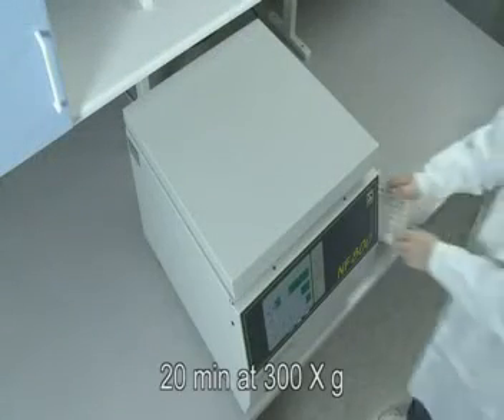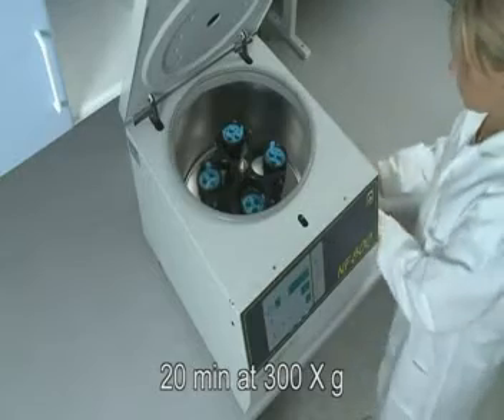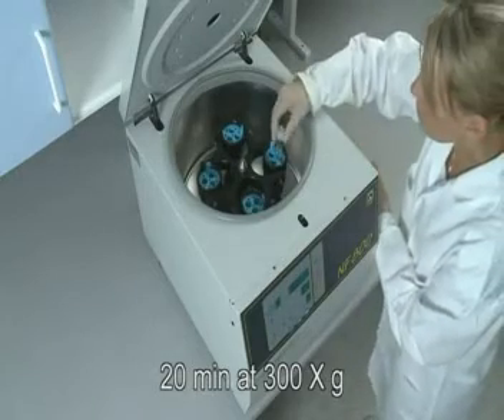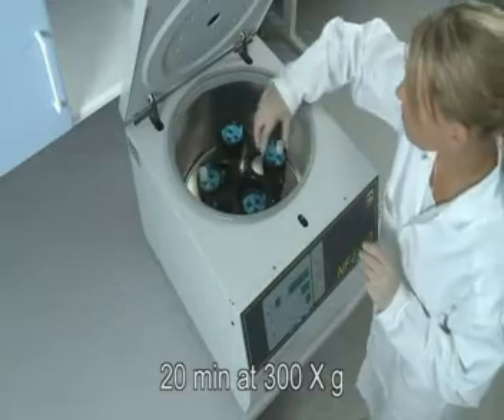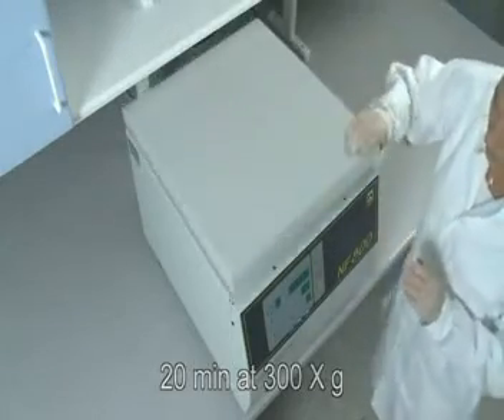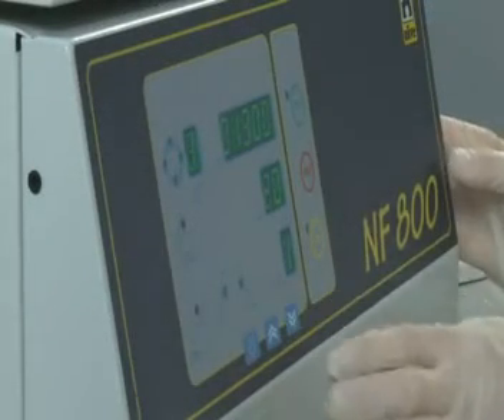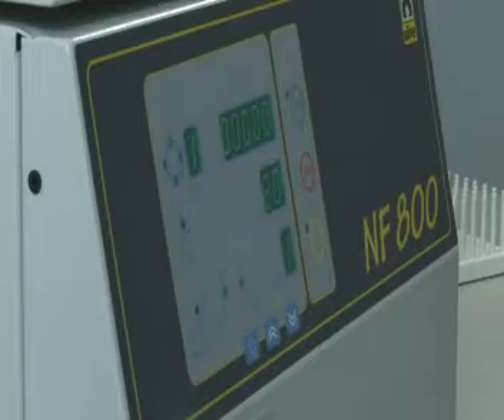Spin for 20 minutes at 300 times G in a centrifuge with a swing-out rotor. Do not use the brake. Be sure to calculate the correct RPM to give 300G for your centrifuge by measuring the radius of the centrifuge rotor, then use the equation found in the product manual on our website.